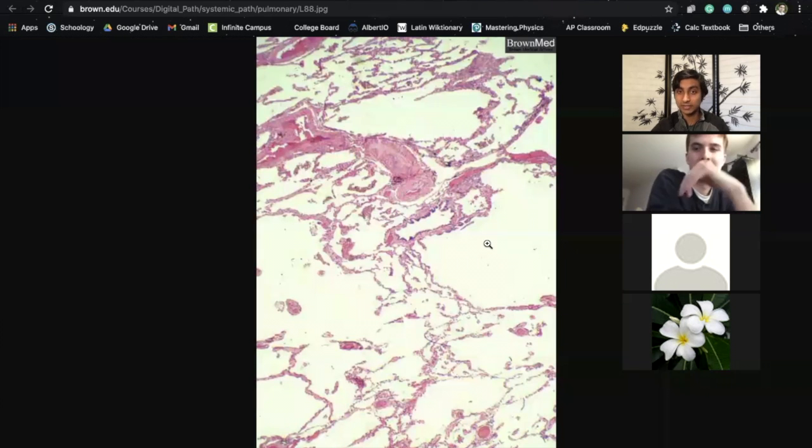And so here we see the enlargement of the individual alveoli, such that they are so enlarged they begin to break down, and the cells no longer form that very nice structure that we saw with the round shape of our alveoli. So that's exactly right. That's one of the ways we can diagnose emphysema, as opposed to maybe another lung condition that might have similar symptoms on a macroscopic level, on a clinical evaluation. But here's one way we can know for sure that emphysema is what is occurring.